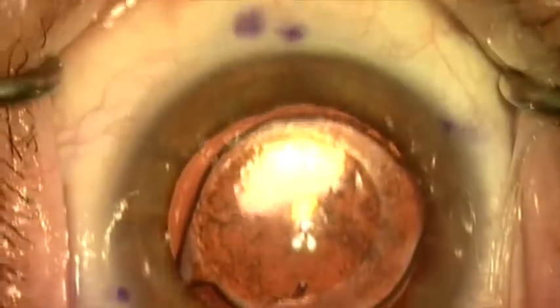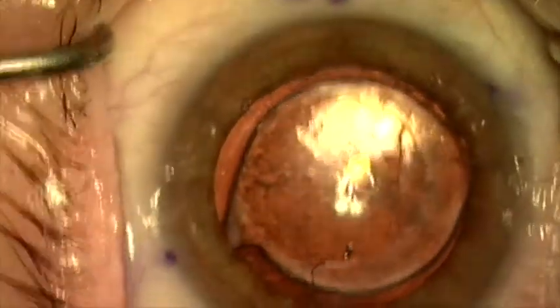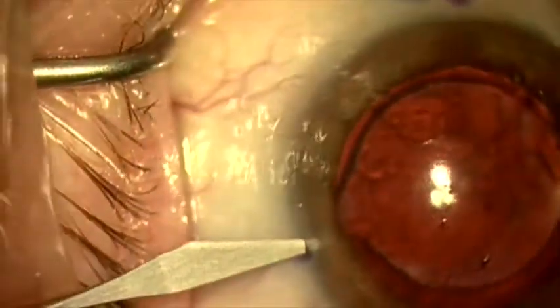This is a case where we're removing an AkraSoft Toric lens placed about five years ago on the incorrect axis to correct astigmatism. We're going to replace it with a Symfony Toric lens.